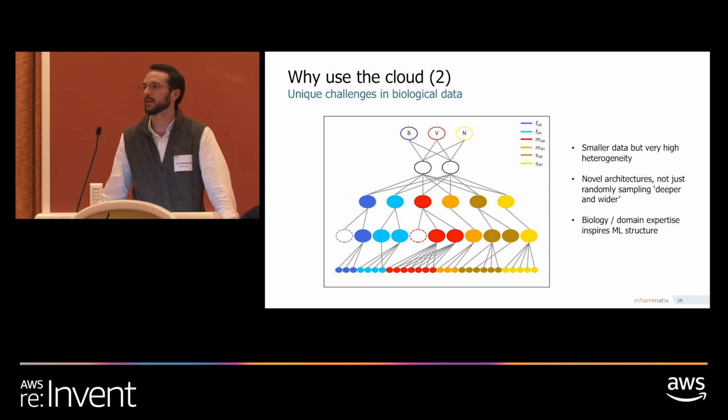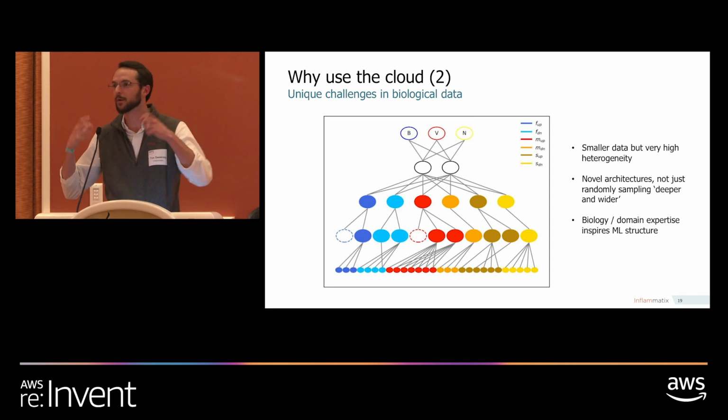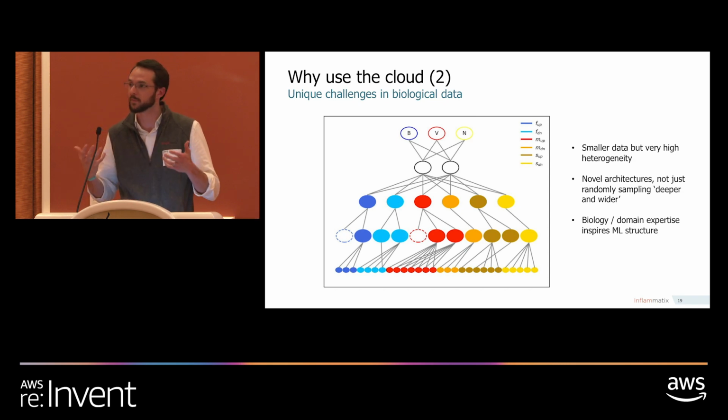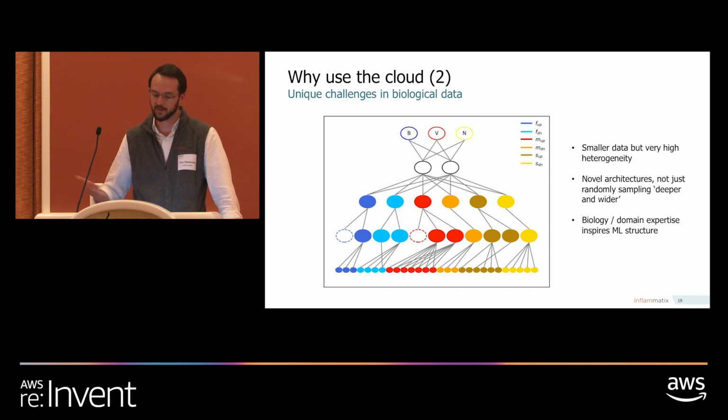But those kinds of insights, you have to test them, and there's no automated way to test for, should we put the severity genes sideways above the diagnostic genes or underneath? It takes biological insight when you're building these things, and so each time it's a new search, and for us that means we have to be on grid. And then of course, when we move to things like Bayesian optimization or whatever, each time it's a massive new search. So for us, the ability to rapidly scale up during periods of great need has been a game changer.